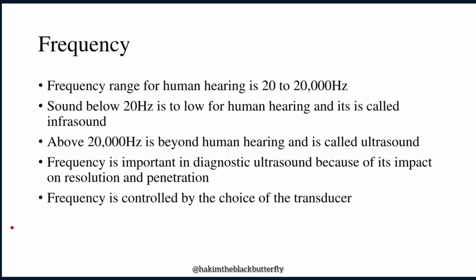So, frequency is very special in ultrasonography because it has an impact on resolution and penetration. The higher the frequency of the ultrasound beam, the lesser the penetration, but the better the resolution of the image. So higher frequency beams produce better images, but the beam does not penetrate deeper. Whereas low frequencies penetrate deeper, but they produce poor resolution images.